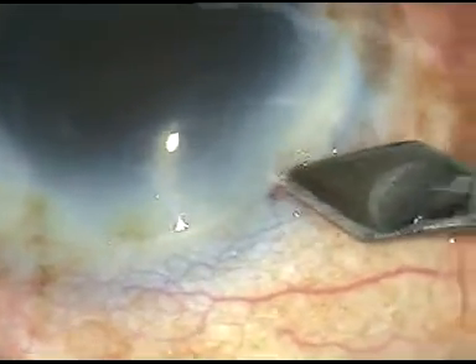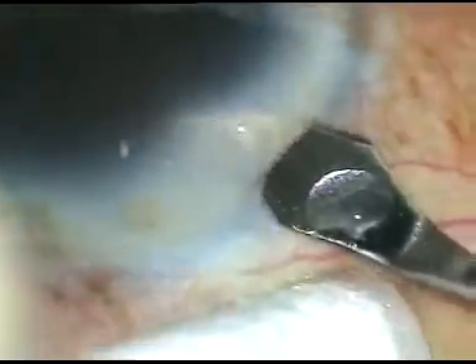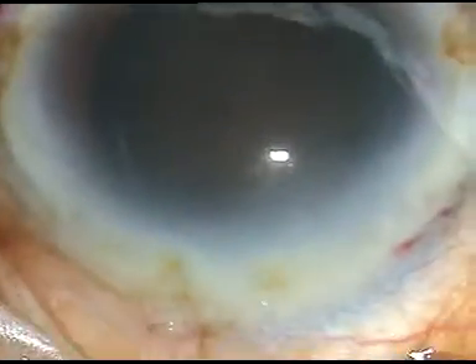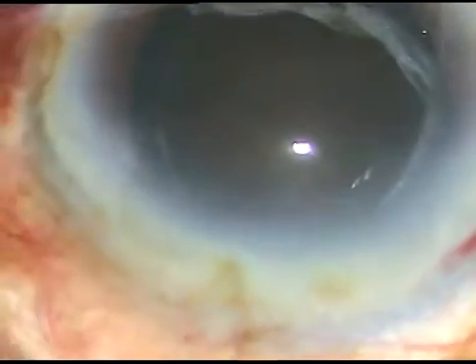I have taken up this case for surgery. Now let us see how this surgery goes. The main incision has been placed at a selected site — it is a posterior limbal incision. There is a thick arcus senilis in this case.